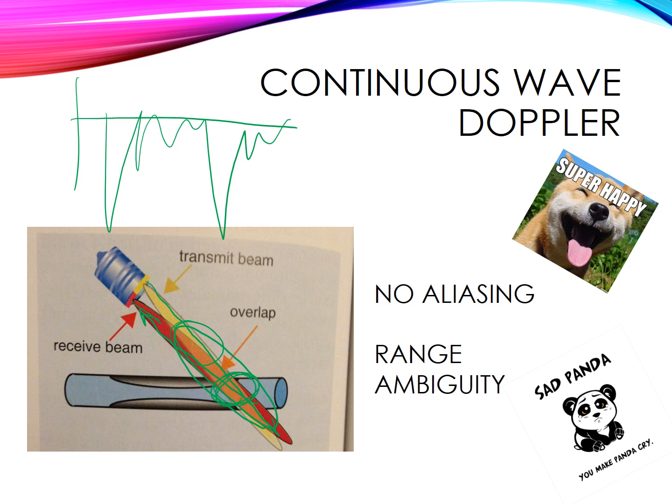The problem with that then is that we get some range ambiguity. We don't know if these reflectors are coming from high up or are these reflectors coming from lower down into the body. So that's the range ambiguity part of it. We also can't say for sure are they strong reflectors versus deep reflectors because we can't TGC through our continuous wave. So if we're getting some light reflectors in here, it's hard to say is it just a deep tissue problem or is it truly a low amplitude reflector. So continuous wave has a little bit of issues with that.